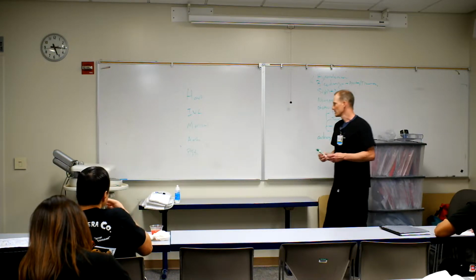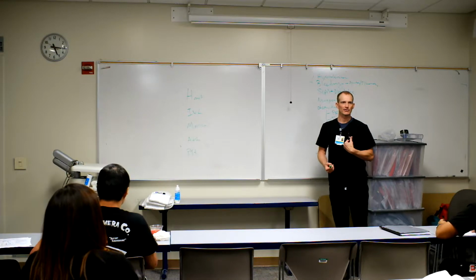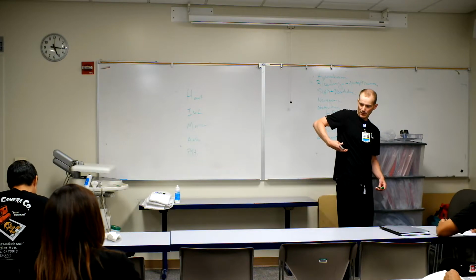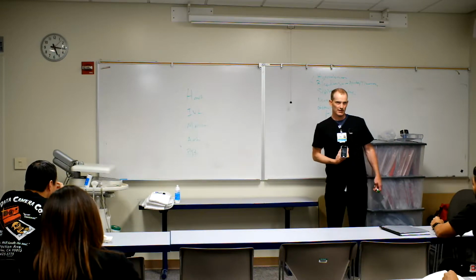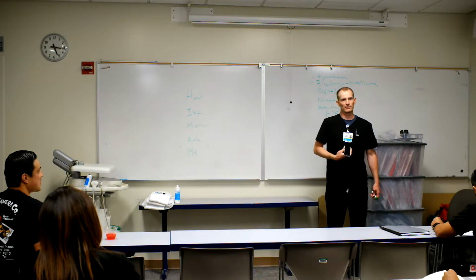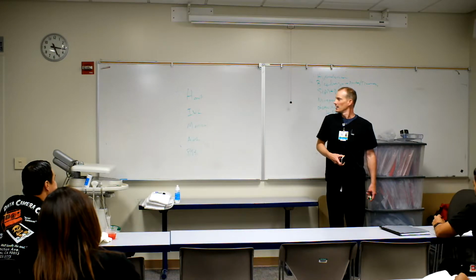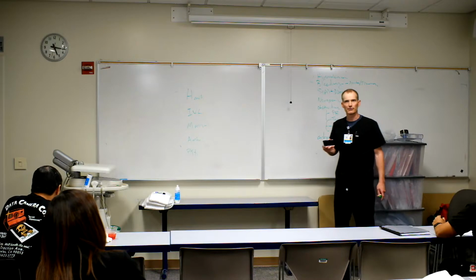So the views are going to be the parasternal long, and you can just rotate to parasternal short, subxiphoid, right upper quadrant with the ultrasound probe like this. And then subcostal and IVC. You can throw out the parasternal long and short if you're satisfied with your subcostal or subxiphoid. So you can get the heart and the IVC out in one if you wanted. Aorta. And then lungs, just like with B lines, except here you are looking for B lines but also looking for a pneumothorax.